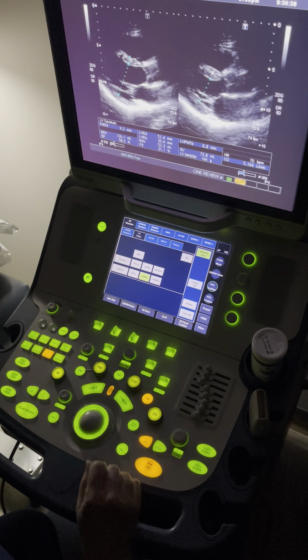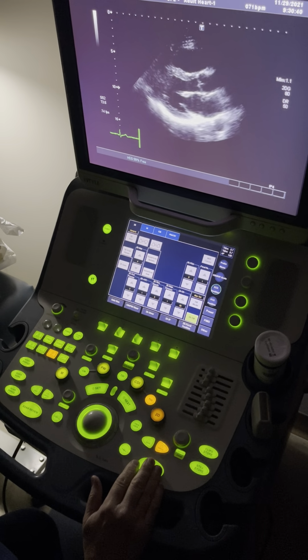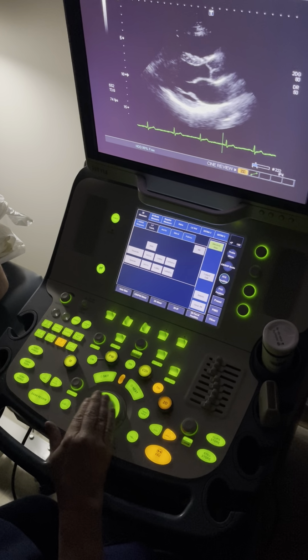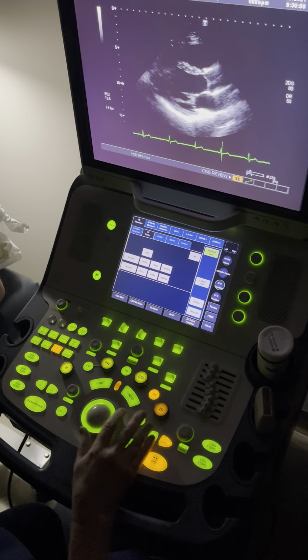Okay. Then if you have a good picture, you can do it, or you can just kind of focus over here on the aorta and the left atrium. Again, in diastole. In systole, aortic valve, AO diameter, this is the sinuses.